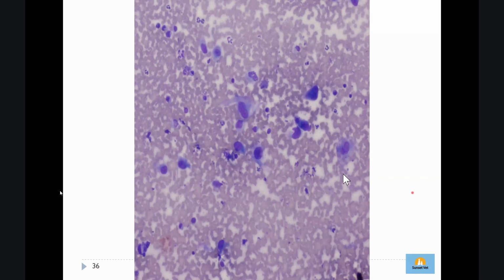Okay, let's say some of you are still not sure, doctor. Is it the inflammation or the cancer? From the big picture of this one, which one do you think is more obvious? If you just blink your eyes, what is the most noticeable thing? Is it the inflammation, or the obvious cell, like I don't know what's going on with the cell?